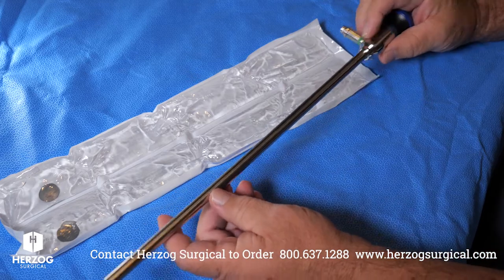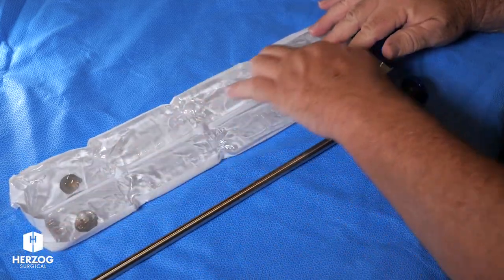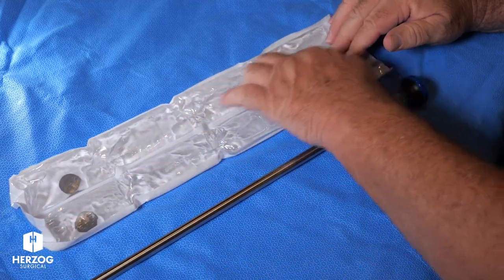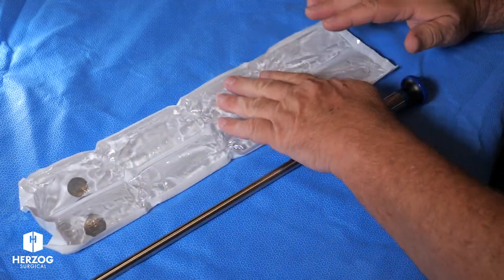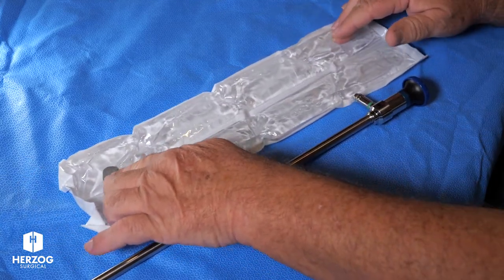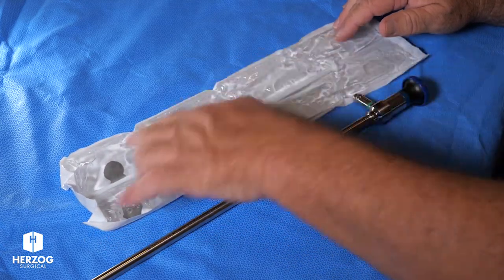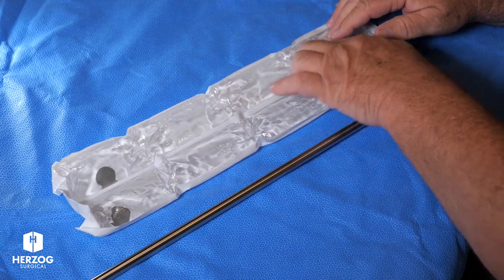We're going to assume we're using one scope for this procedure. All this is, is a super high concentrated salt solution in each side. The way you get the salt out of solution is you just bend one of these coins, and it causes the salt to come out of solution. When it does that, it releases heat, so this gets warm.